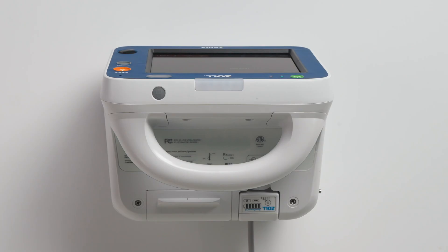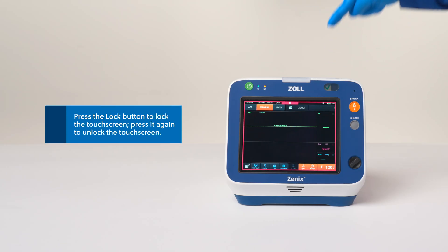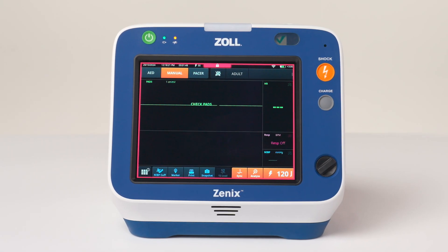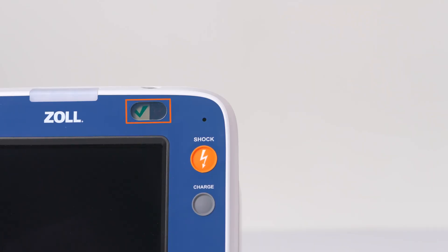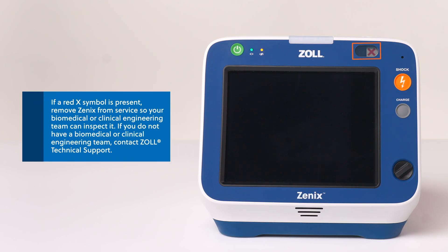On the top of Xenix you will also find a screen lock button as well as the device handle. Pressing the screen lock button locks the touch screen, displaying a red border around the screen and a lock symbol at the top. With the screen locked, navigation must be performed using the rotary dial. The Xenix ready-for-use indicator shows the device's status. A green check indicates Xenix is operating correctly. A red X indicates that the device may not be ready for therapeutic use. Do not use or place Xenix in service if the ready-for-use indicator displays a red X, unless during a code.